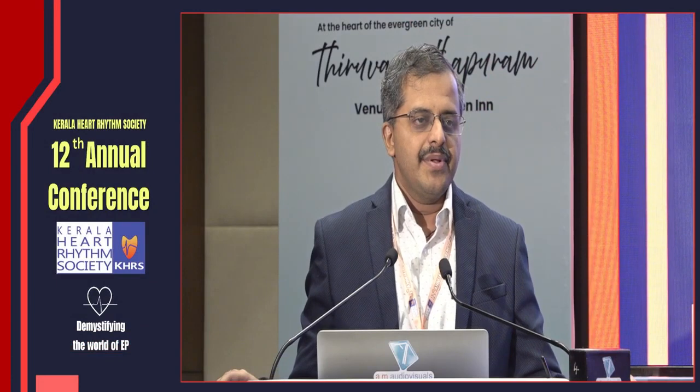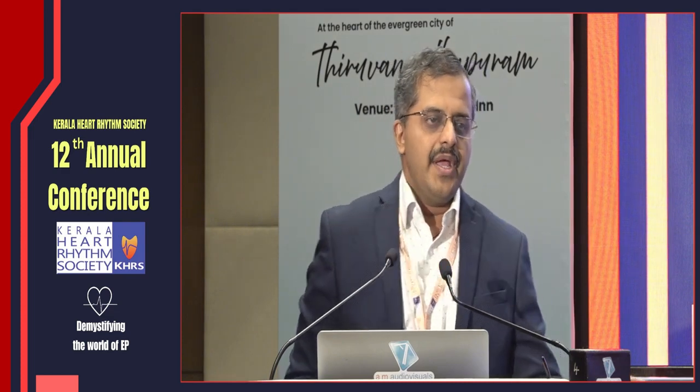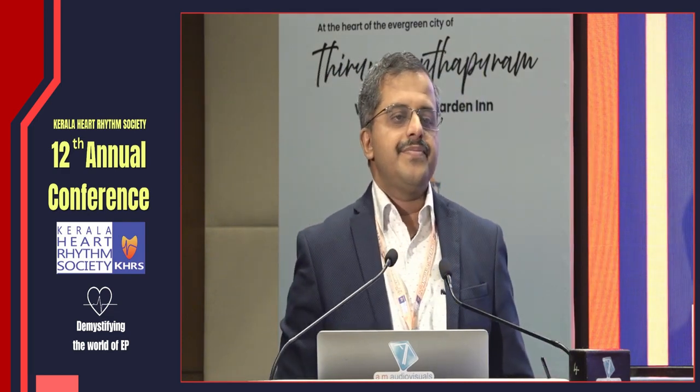It will not be an ideal puncture. So we had an RF with a Watchman here, which is quite okay. You are thinking of a cryo with a Watchman. You preferably go in the fossa, lower side, not much anterior or posterior. I had a problem because I tried through the same sheath to close the appendage and it applied.